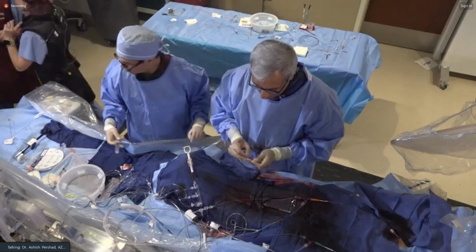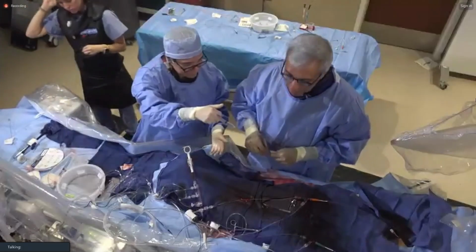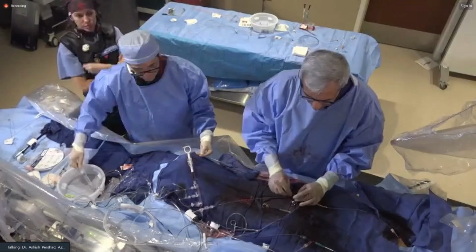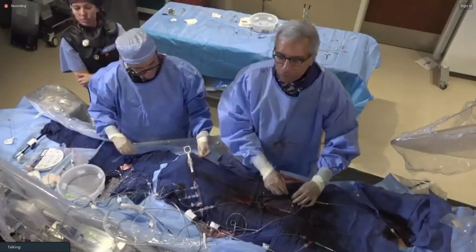Get us a new balloon. New balloon, please. It's okay, got it. Which one are you taking down into the PDA there? No, this is just a balloon just to track my guideliner, drop liner down to all those stents.